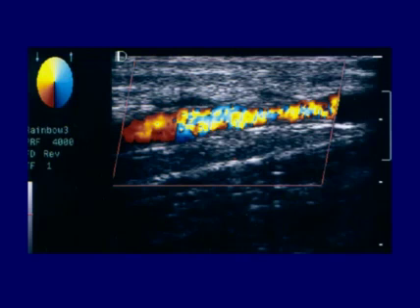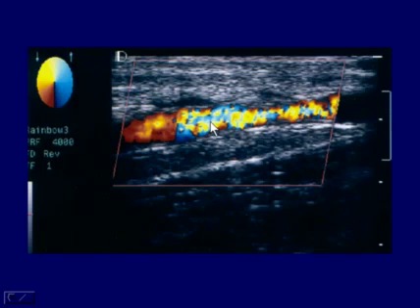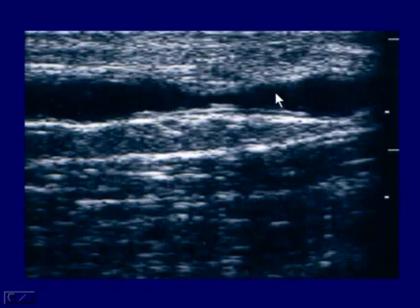In this example here of this bypass graft, we can see nice healthy color flow over here, nice and red, looking good. But as we go down the vessel here, well, what's going on? What's going on is that we're seeing a lot of aliasing. Something is impacting that signal. So what is that something? Well, we take the color off and we look and we see that there's this major stenosis here. And whether this was a missed valve or hyperplasia or new plaque, it doesn't matter. We've identified it both on color and on grayscale, and it has to be fixed.